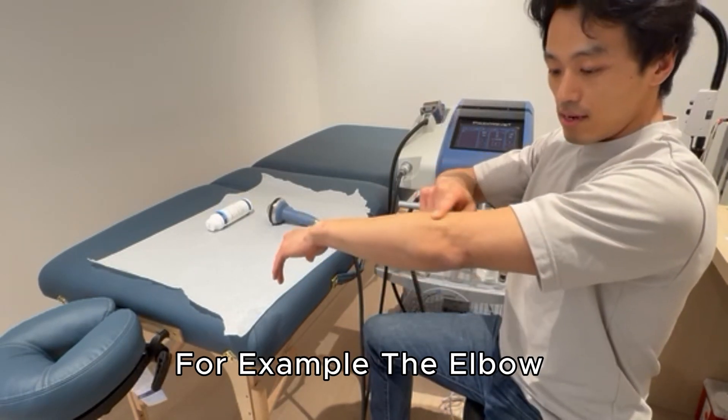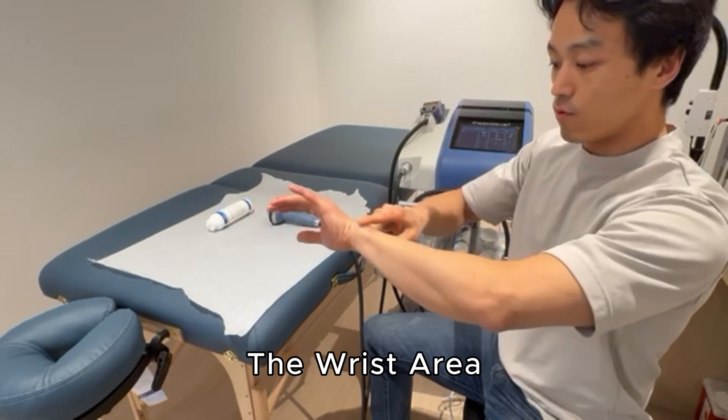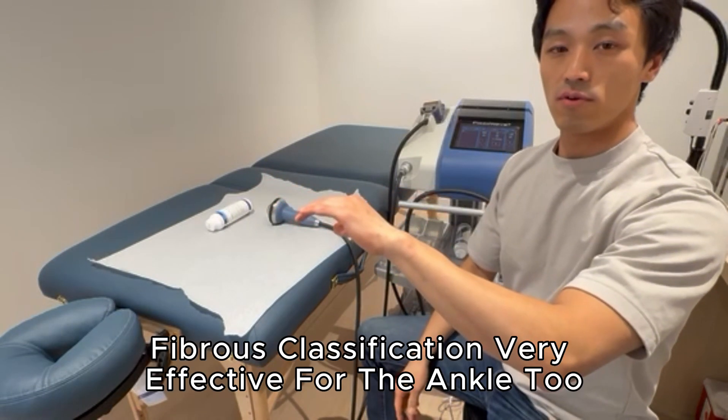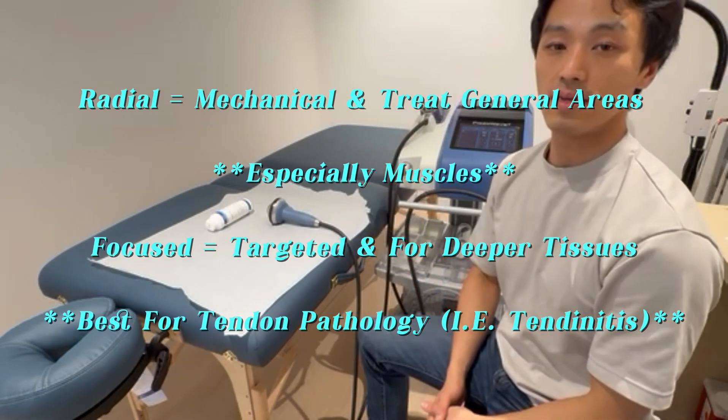For example, the elbow — lateral epicondyle, the tendons over there — that's really good. Also the wrist area, finger area, around the bone where there are tendons, scar tissue, adhesion, fibrosis, and calcification — very effective. Ankle too; ankle sprain is very effective.